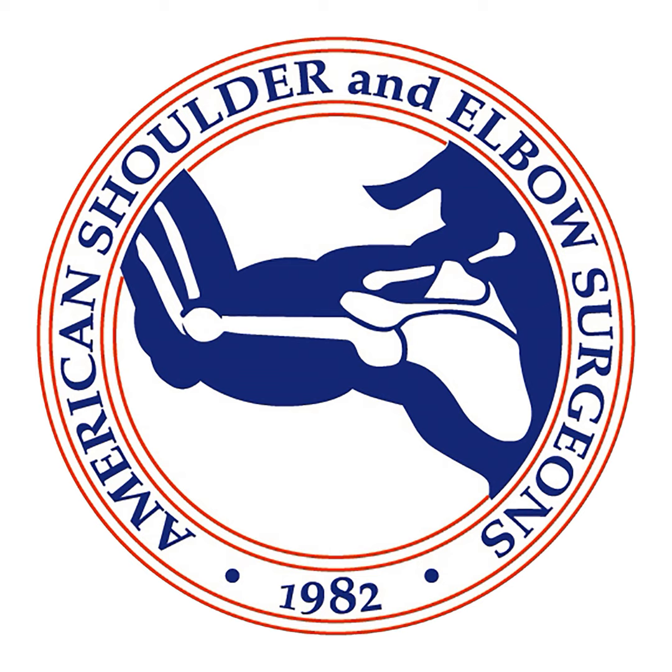Has that been your experience as well, Dr. Sperling? It really has. I think that for me, the revision has definitely been easier, and I think it's refreshing. Some of the worst parts of my practice are removing cemented stems, and the ability to revise an uncemented stemless implant is so much better in that regard. So I think you're not sacrificing in terms of fixation.